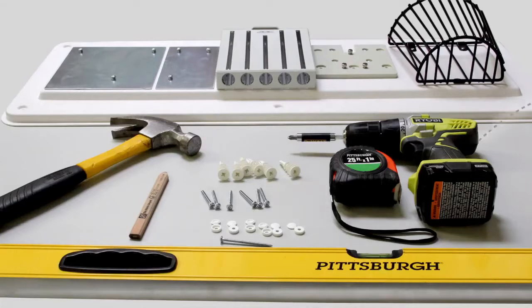Additionally, you will need a number 2 Phillips handheld or electronic screwdriver, a tape measure, a level, a marking pencil, and a second pair of hands. You may also want a nail and a hammer to mark the holes.